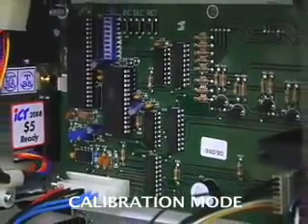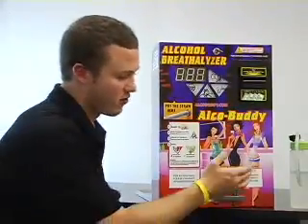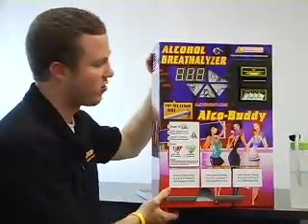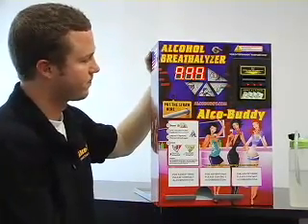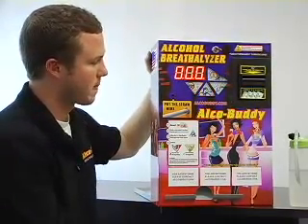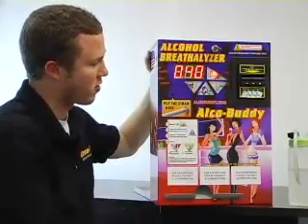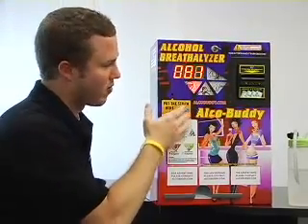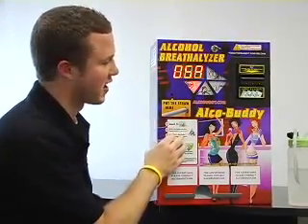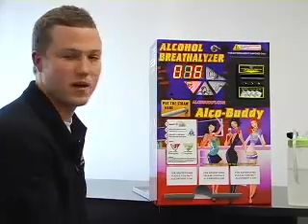Now I'm going to show you the final step for the calibration. Now that we've created the solution and put the machine in calibration mode, let's start the machine up. You'll see it flash 'calibration.' Every time we're in calibration mode, there's a 10-second countdown. We're going to miss the first one, but you'll continue to blow as many times as necessary.